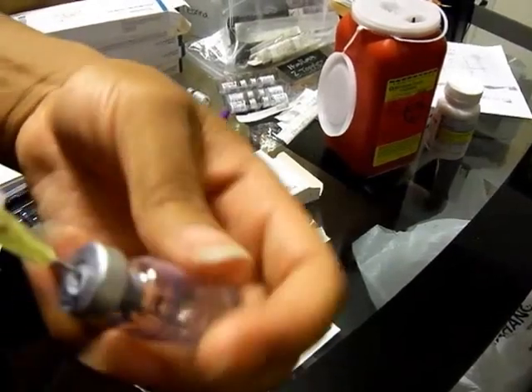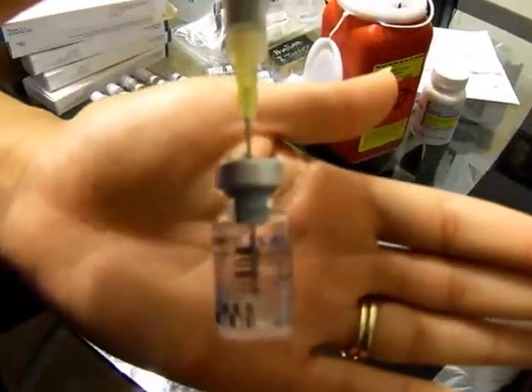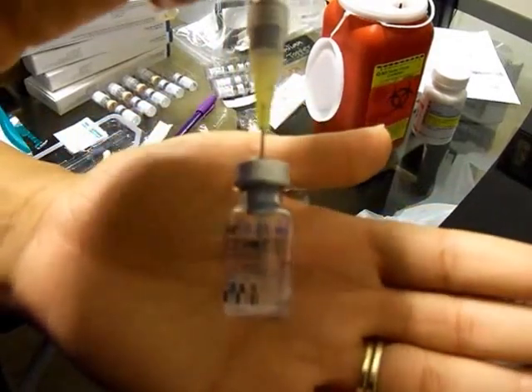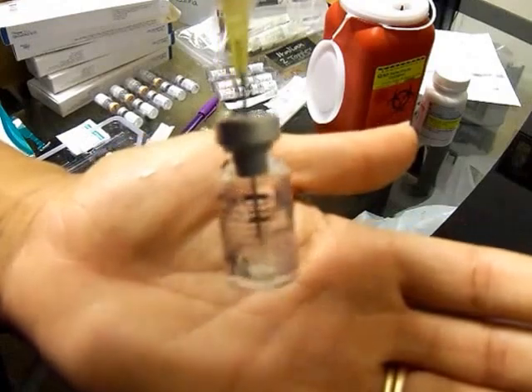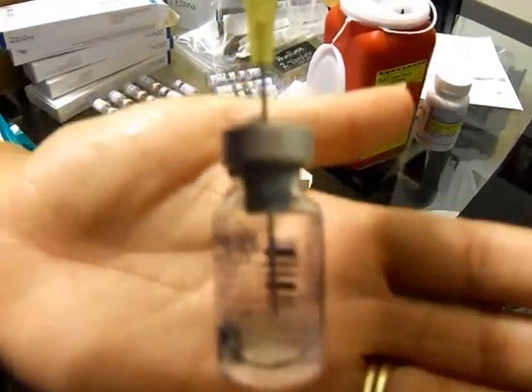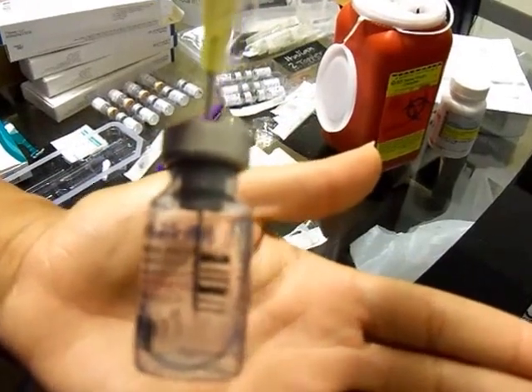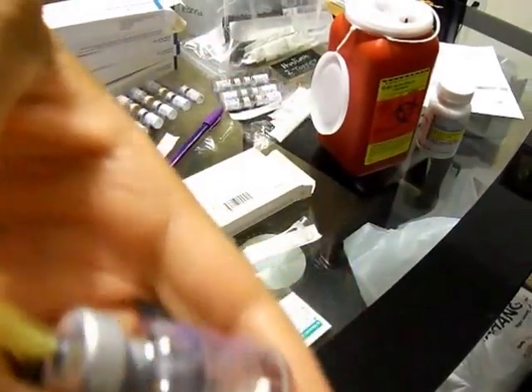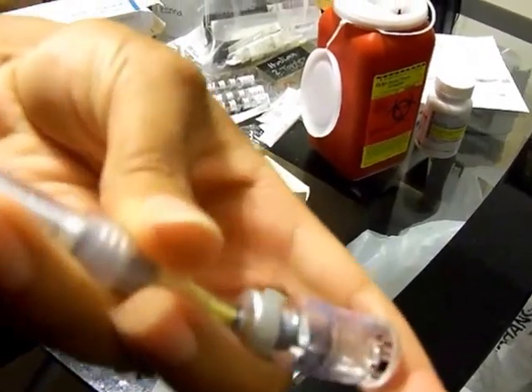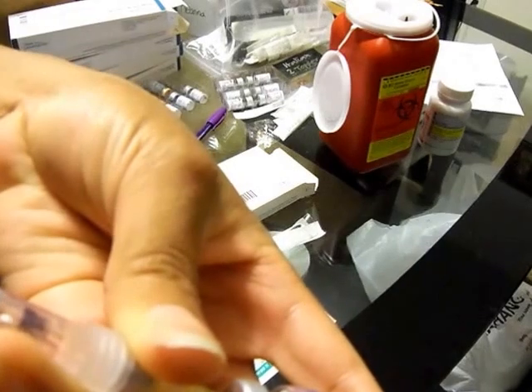Once you're done mixing it, it should look like — you can't see it on camera — but it should look like this. It should be in liquid form where you can do this. But it's all mixed up together already. Now you want to take it like this and just pull all the liquid out.